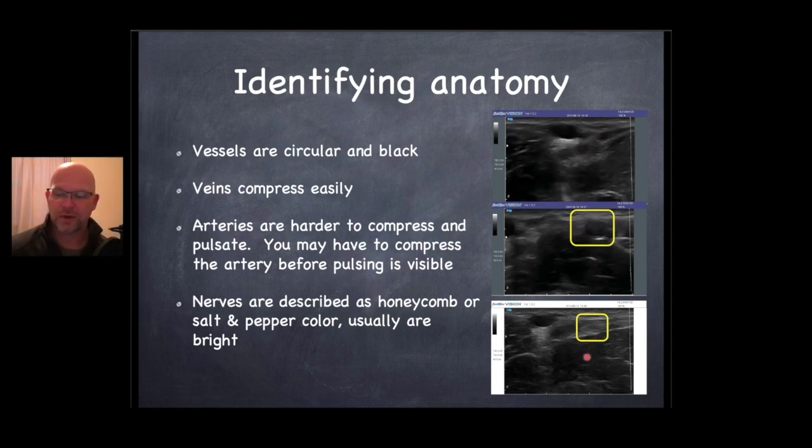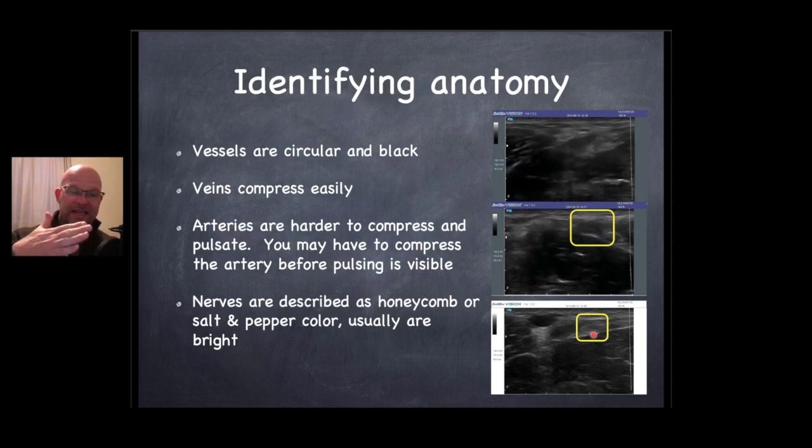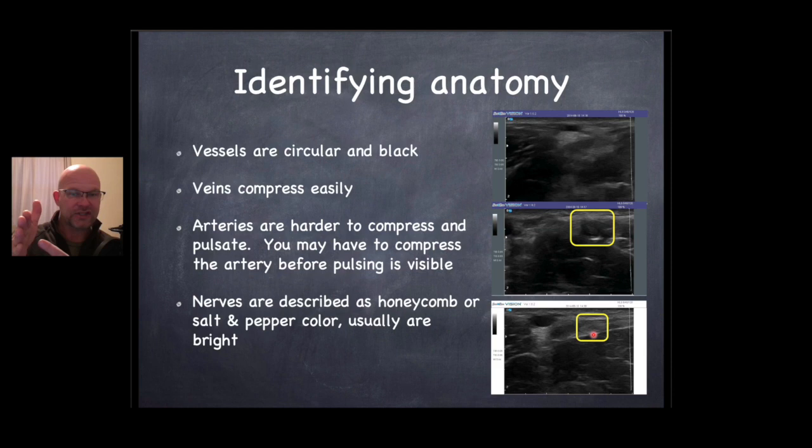If the vein was located underneath this, I might look for a different area, because a lot of times you'll find that the veins and the arteries are stacked up on top of each other. You'll see that they twist. You'll see T's, so it'll actually come in and it'll actually T.